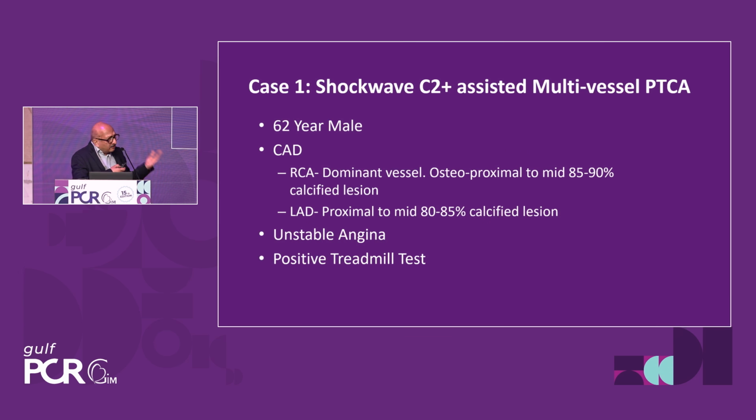So quickly, for multi-vessel disease, again, this is our good choice. Because in these patients, we do not want to do so many steps at a time, because one wire does it all. And one balloon sometimes does it all, because now with the multiple shots.